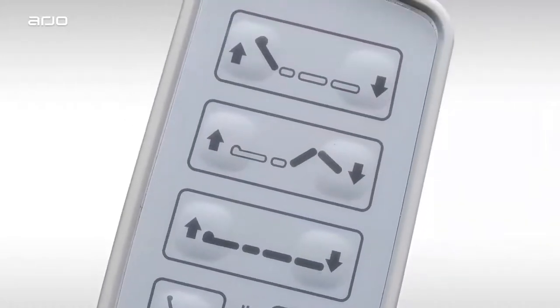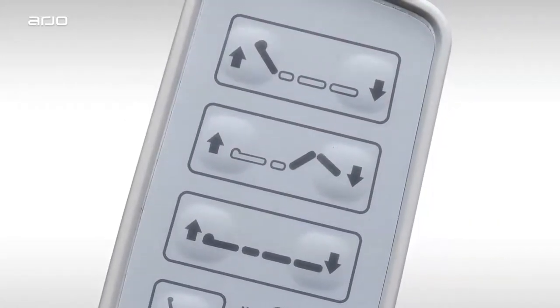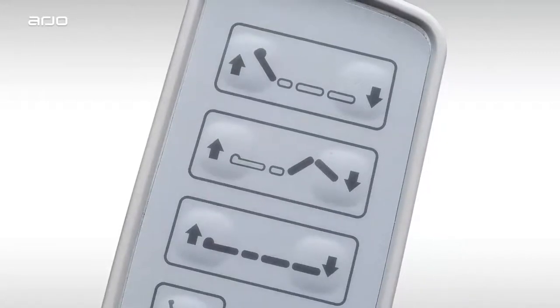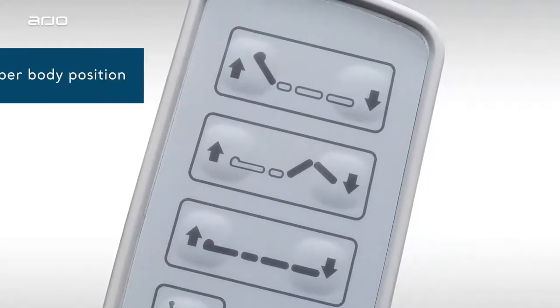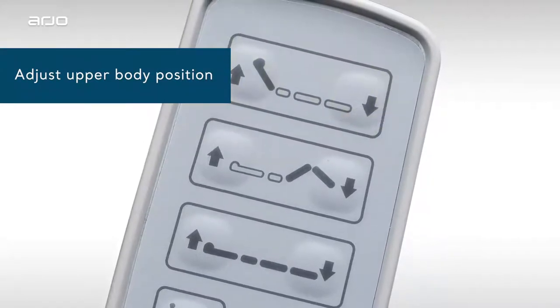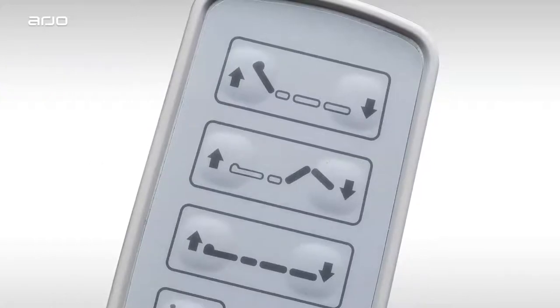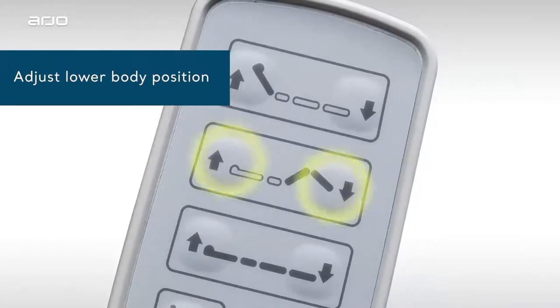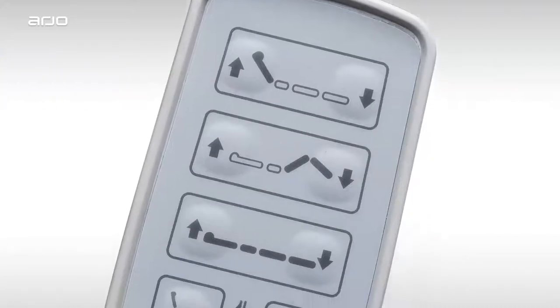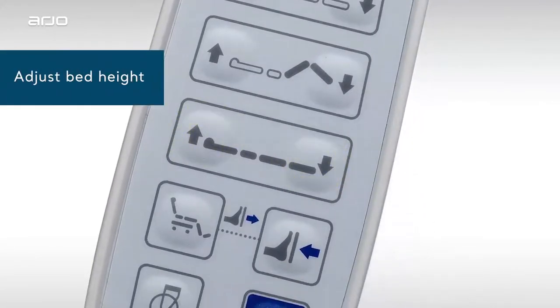The top of the Total Lift Bed Hand Pendant features a layout that mimics the look and feel of the bed rail control pads, making it easy to learn and operate. These two buttons allow you to raise and lower the patient's head and upper body. Use these hand pendant controls to raise or lower the patient's lower body.